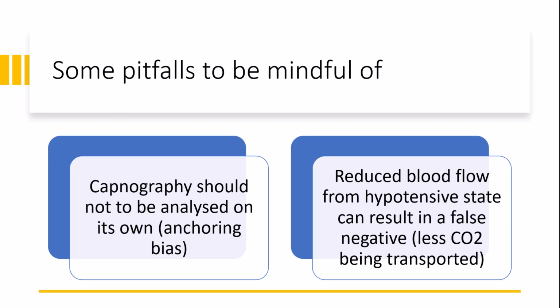All of that should be done in the context of additional history taking, because capnography can show a whole range of different things. And if we were simply just to be looking at the end-tidal by itself, we can very easily go down the wrong route and, of course, potentially have a bad outcome. So it's just one extra tool you can think of when you're going down that path of, is this patient having an infection and how severe could this be?